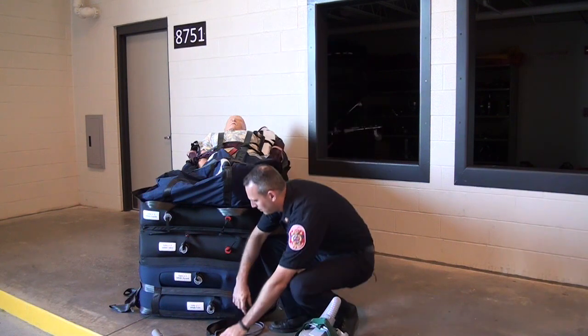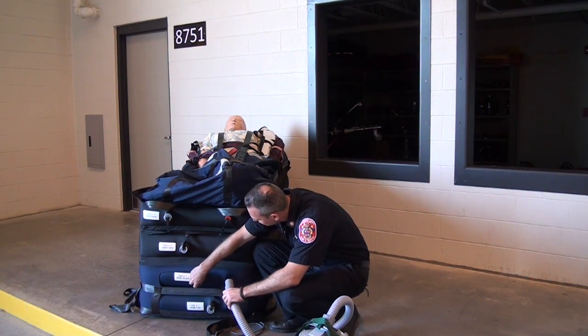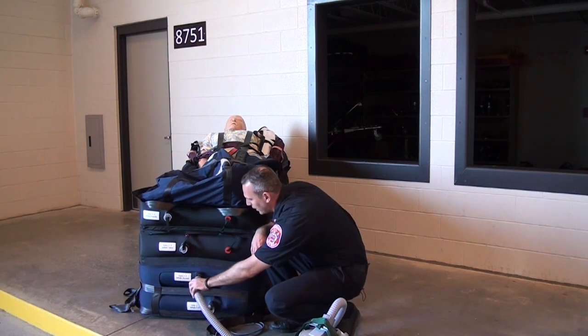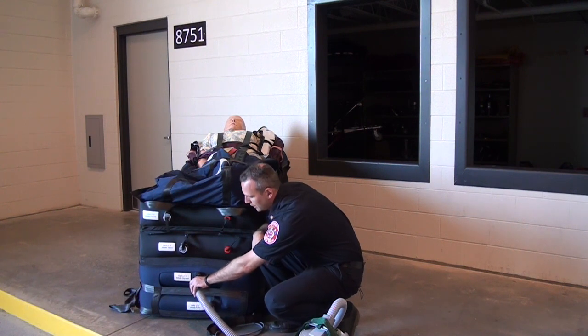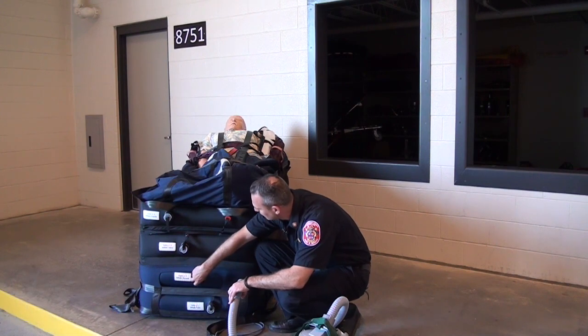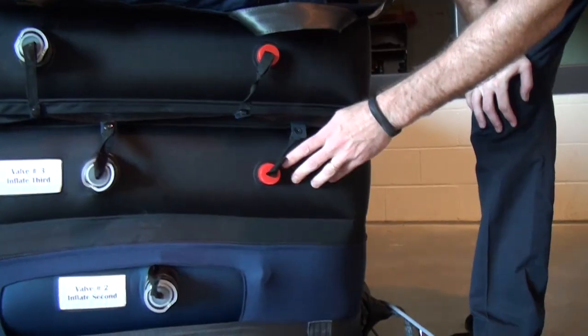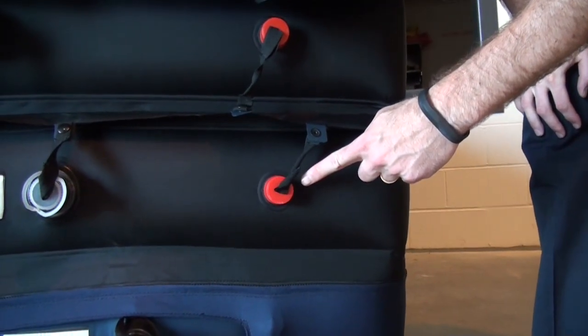The air pump is attached to the black valves on the left. It's as simple as holding the air pump to the valve until the chamber is filled and then securing the cap afterwards. The red valves on the right are for deflating the chambers as we're moving the patients.